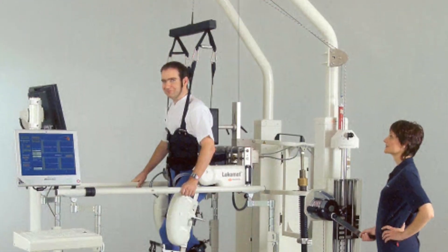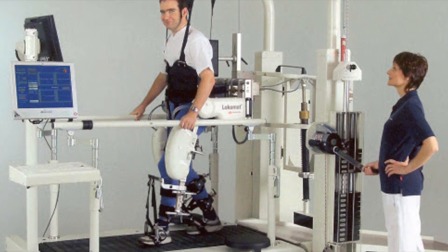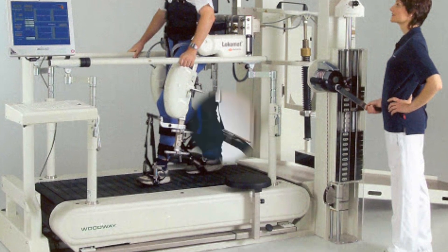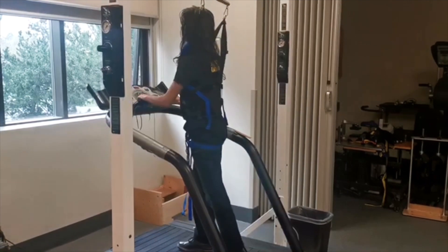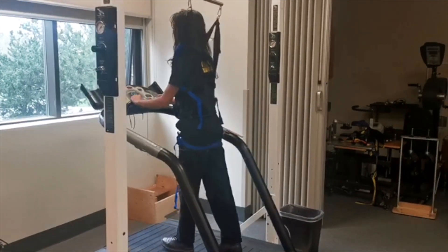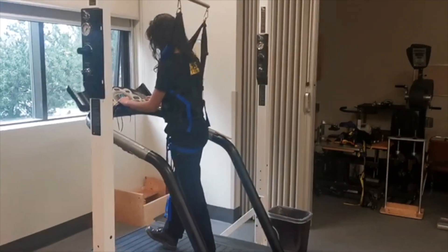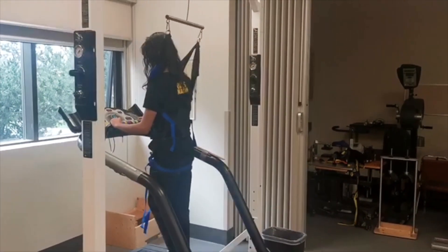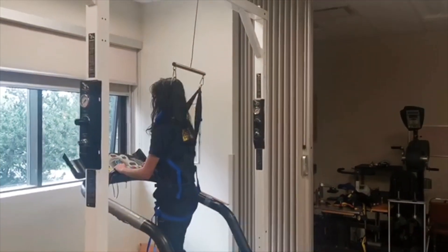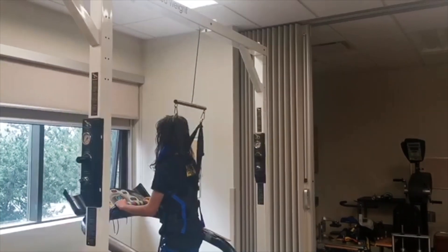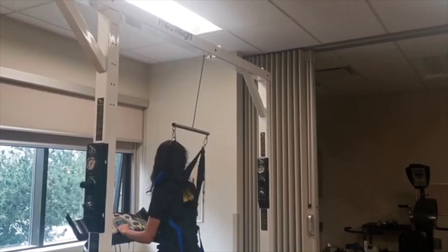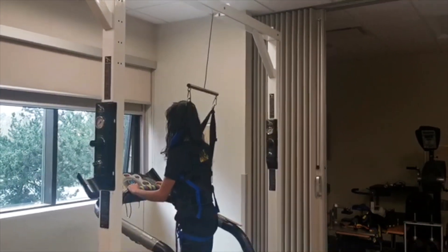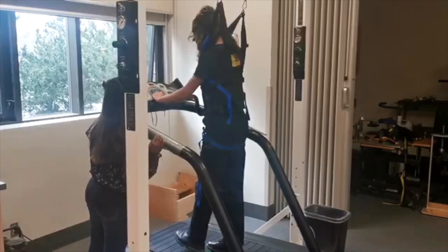The next research we will talk about is the BWS treadmill training. Body weight supported BWS treadmill training is a method for retraining walking. A person using BWS is supported by a harness suspended from a metal frame. The harness and BWS both provide support and reduce the weight on their feet while they walk. The amount of support can be increased or decreased depending on their particular needs.